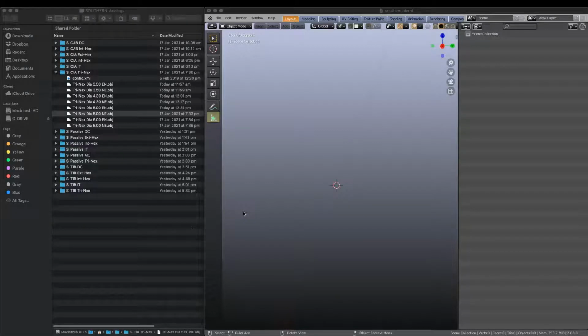Hi again. In the previous video I demonstrated how to join 3 STL files and turn those into one OBJ file. Now if you recall, in this OBJ file we had a scan flag, we had the implant or the analog, and we had something called a negative. Now the negative is the mesh geometry of the actual hole. Now you might recall that I mentioned that we have to turn this geometry of the hole into an actual object. So this object will then be placed into a finished model.